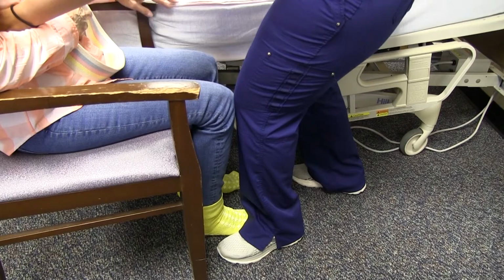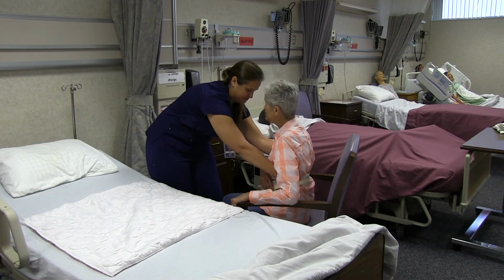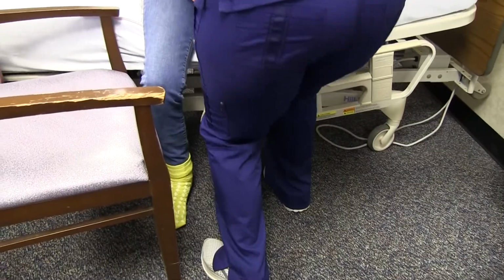Supports both of client's knees between or against own knees. Moves own pivot foot back 6 to 12 inches, foot closest to the bed. Places arms around client and grasps gait belt firmly from underneath along client's sides. On count of 3, while straightening hips and legs, keeping knees slightly flexed, pivots on back foot and guides client to sitting position on bed.